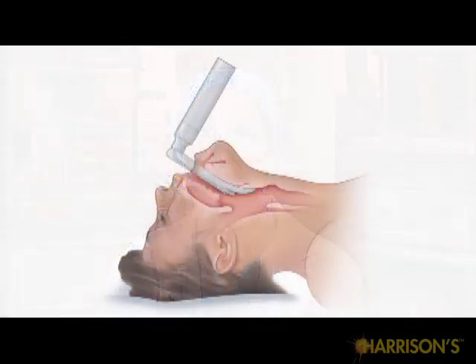patient's mandible. The Miller blade should be placed posterior to the epiglottis and used to pull the epiglottis out of the way. Therefore, only vocal cords should be visible. The Miller blade should be placed between the cords and the epiglottis rather than between the vallecula and the epiglottis, as with the Macintosh blade.